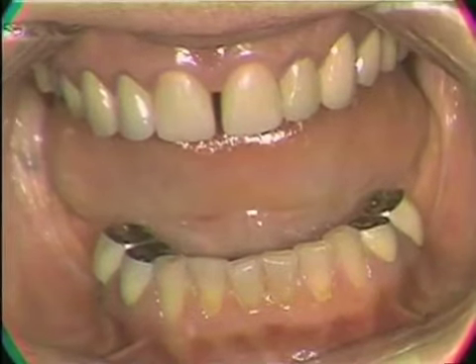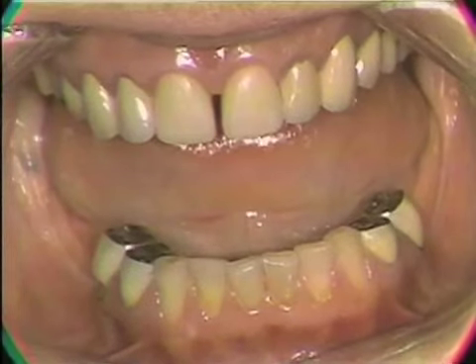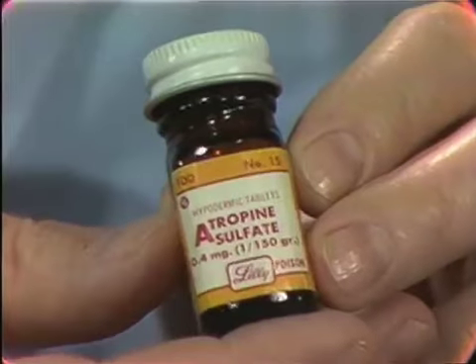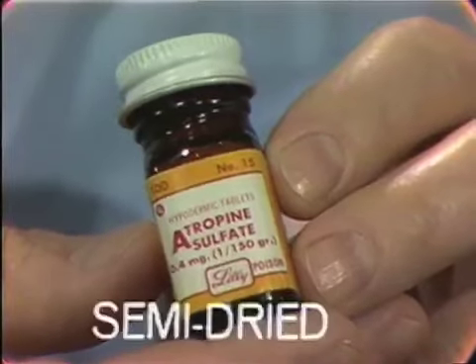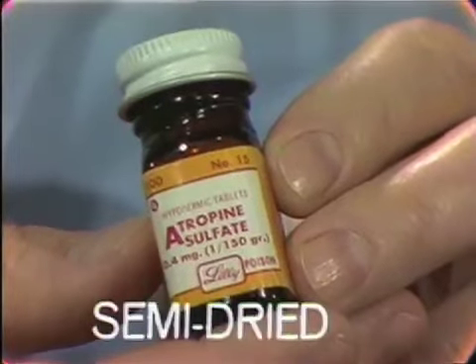In preparation for the impression, we would also want to dry the tissue somewhat. Our goal is to take an impression of a semi-dried, healthy ridge, to get the mouth and the tissues in a semi-dried condition. We premedicate with an antisialagogue.